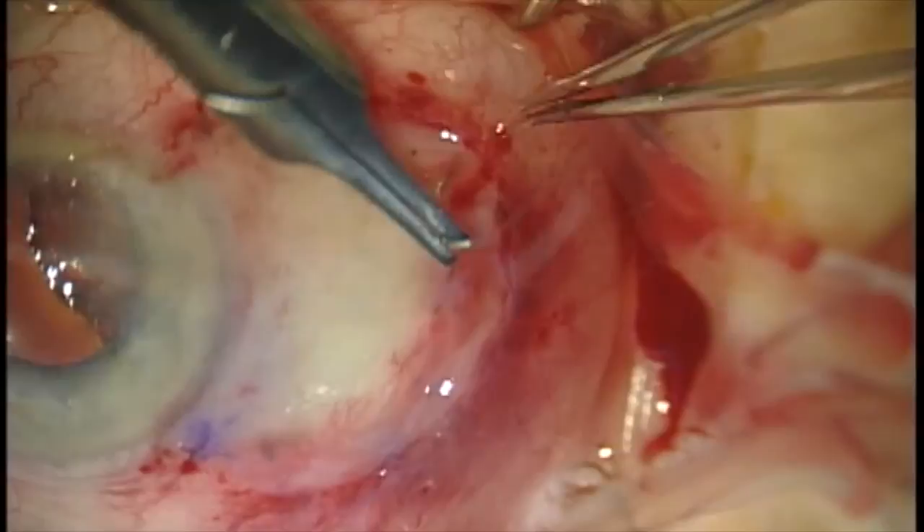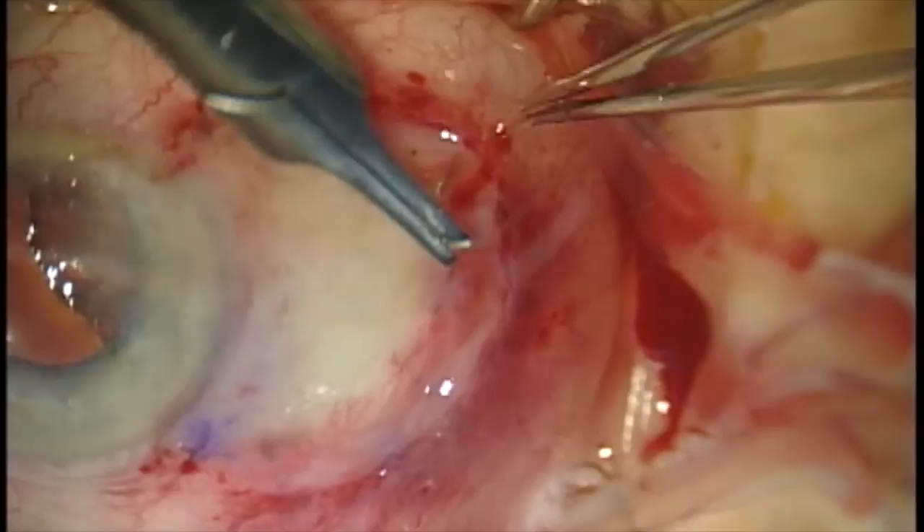The graft does help prevent recurrence and helps prevent a considerable amount of inflammation. Here we're placing two additional anchoring sutures in the cut edges of the conjunctiva, just to ensure that the graft does not slip in the post-operative period. And here's the finished product.